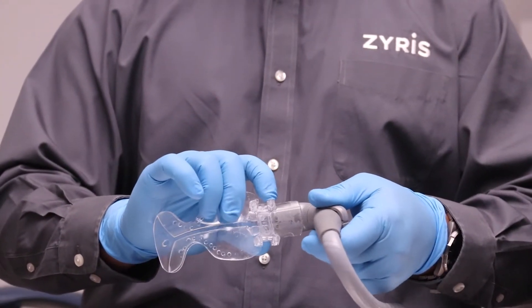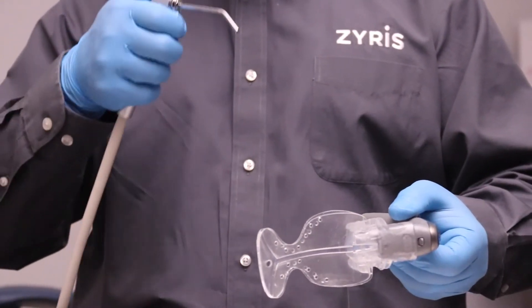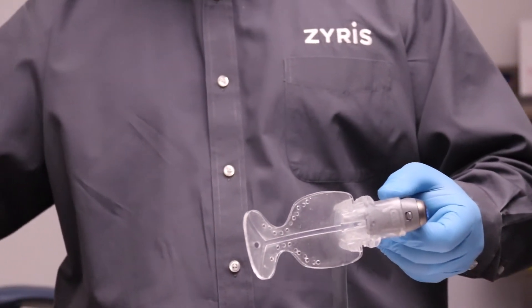When you're about to place the mouthpiece, remember to lubricate the back of the mouthpiece to make it easier to insert during placement.